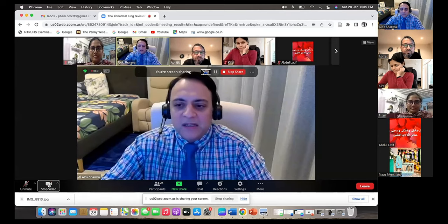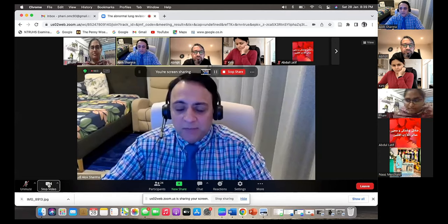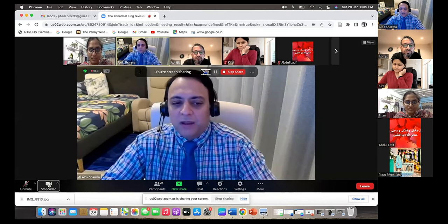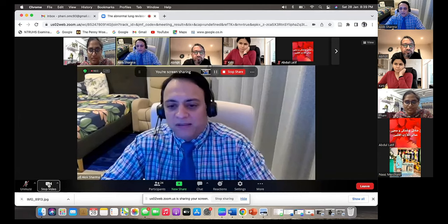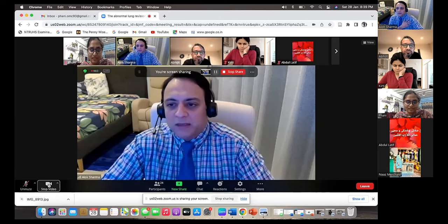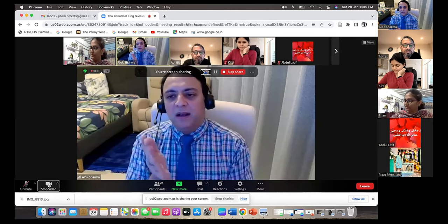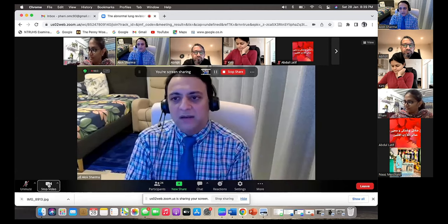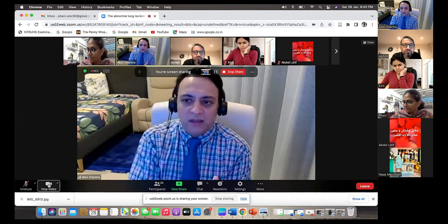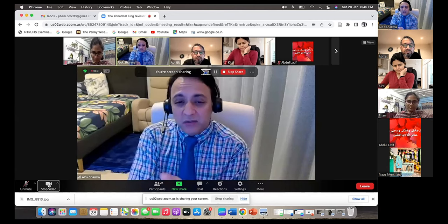Similarly, occasionally when you're on the back, and there's the scapula, the posterior regions can be quite challenging to get really good images at 90 degrees. One thing that I sometimes do is to get the back straight, I'll put a small shoulder roll under the baby, in particular under the shoulder, to get the shoulder straight. I'll also try to image quite lateral to the spine. The back is quite big, and as you slant, sometimes you're more lateral at the back. So try to keep yourself as close or just lateral to the spine and image those areas.